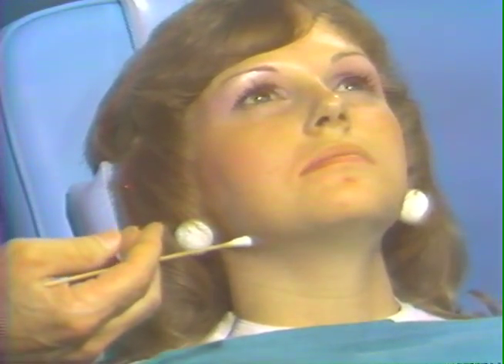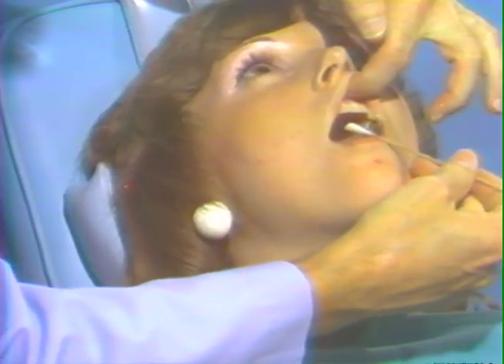The long sphenopalatine nerve emerges through the incisive canal and the topical anesthesia is placed in this manner. Open your mouth again, Betty. Open real wide, relax your upper lip. The papilla lies immediately behind the central incisors. The cotton applicator tip is merely placed into this area and held in position for topical anesthesia with burnishing and removal.